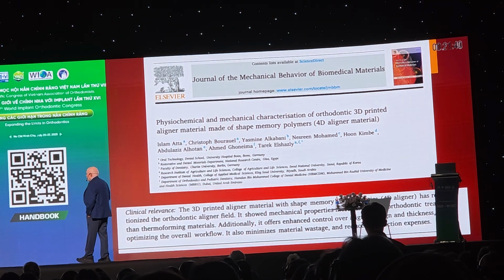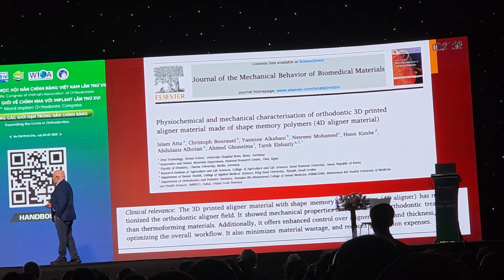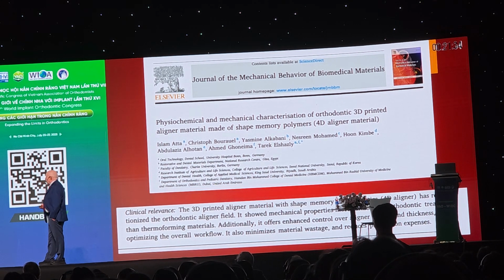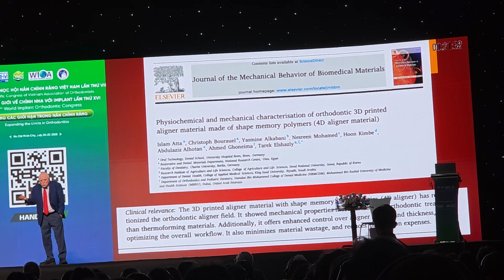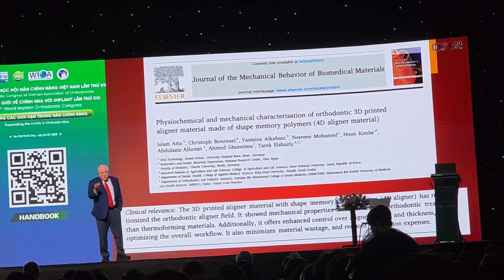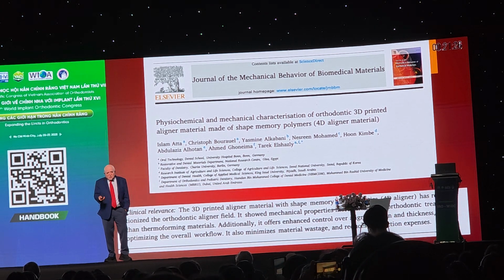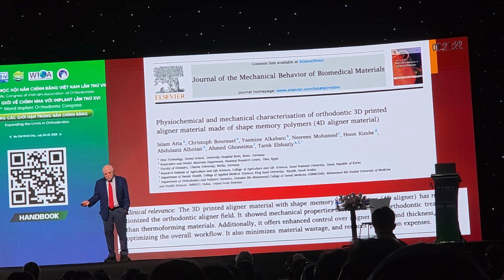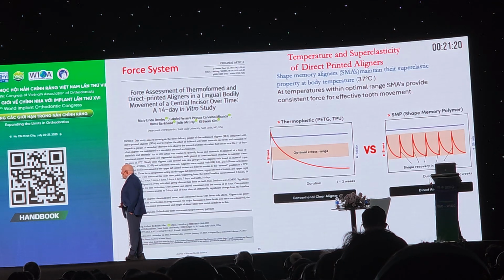Very important. This is a paper that came out on physiochemical and mechanical properties of orthodontic 3D printed aligners. Why am I showing you this? I'm showing you that any question you have about shape memory aligners is in the literature. All of it appeared within the last 4 years. Every little thing you can think of.